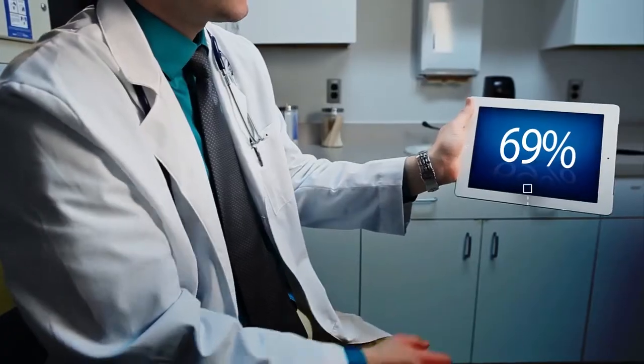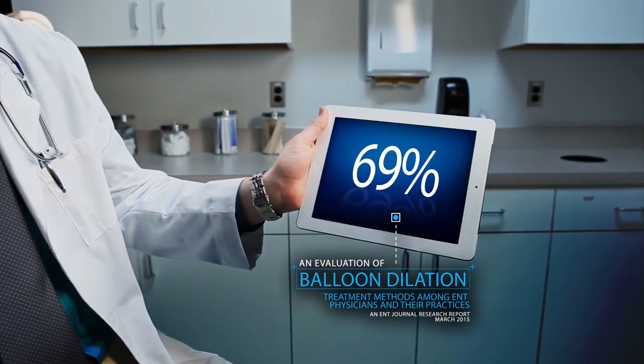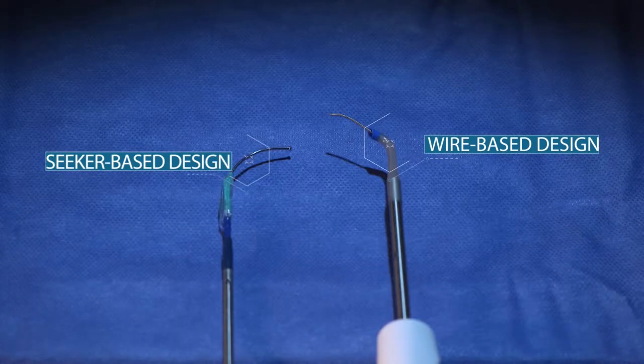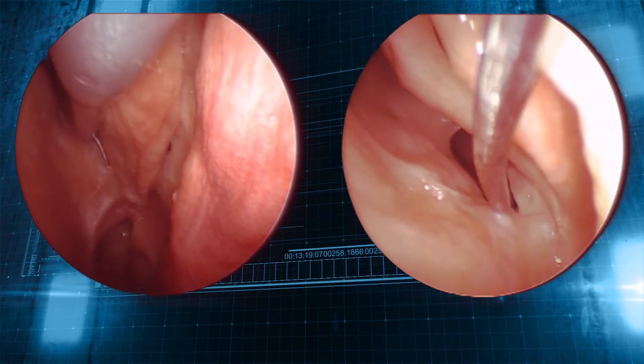Sphenoid sinuses. Only 69% of ENTs feel balloon sinus dilation is effective for treating the sphenoids. But can the right device choice — a wire or seeker-based design — impact the physician's procedural experience and enable them to master sphenoid sinus treatment?